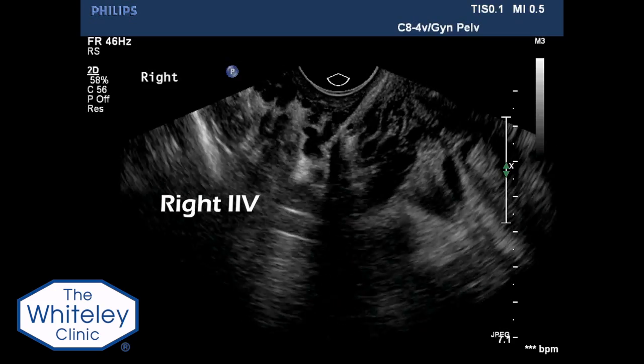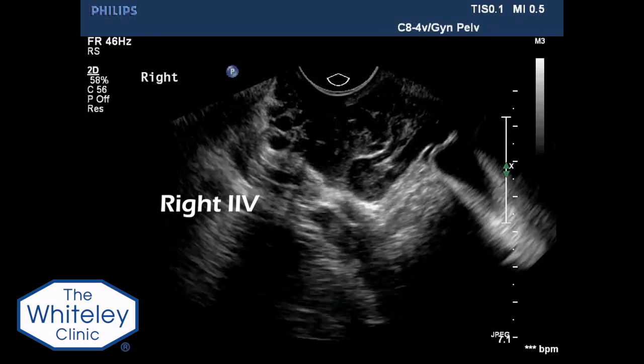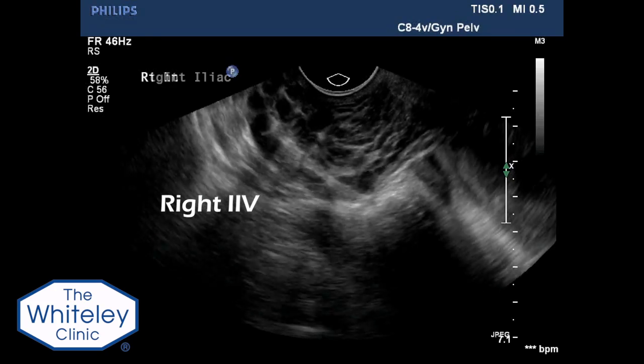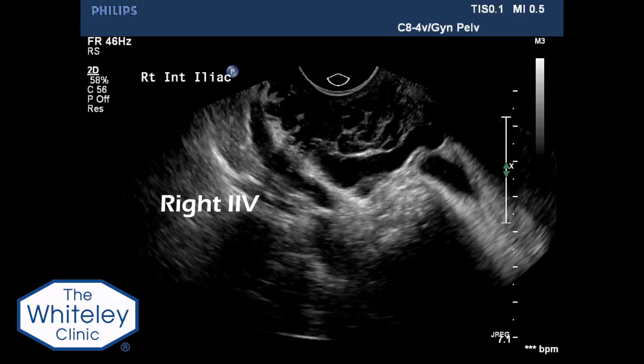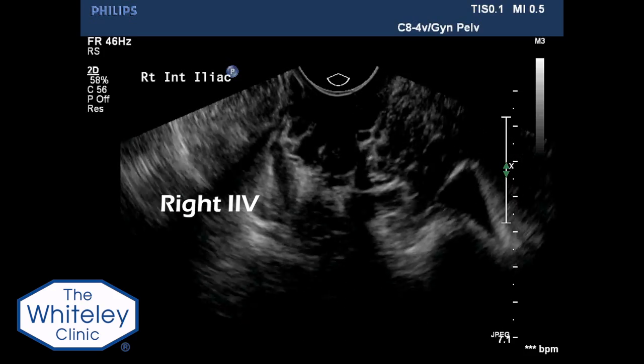The transducer is angled into the right lateral fornix, where the right internal iliac vein can be seen on the lateral side wall of the pelvis.